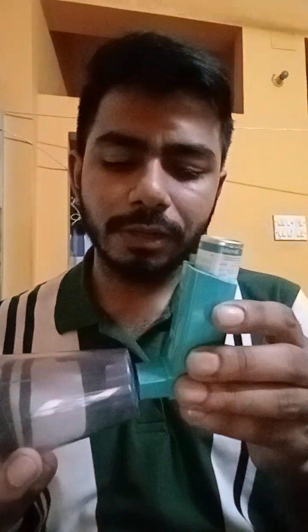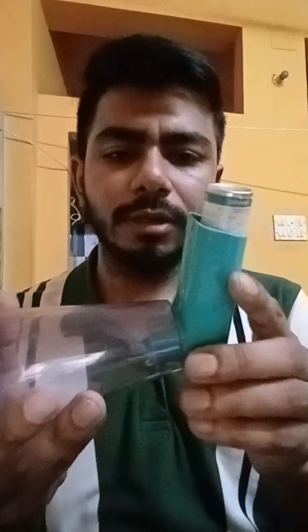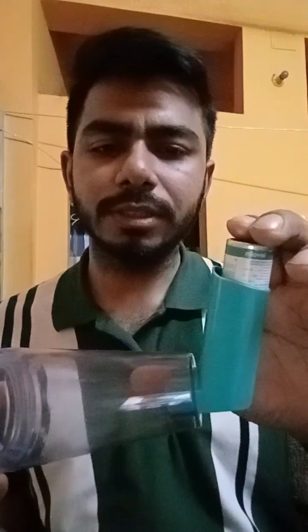So once again, I'm going to demonstrate it. First of all, I will shake the inhaler well. Then I will insert the mouthpiece of the inhaler into the spacer. Once I do that, I will remove the cap of the mouthpiece. I will take a deep breath and then exhale. I will put this mouthpiece into my mouth and then deliver this drug.